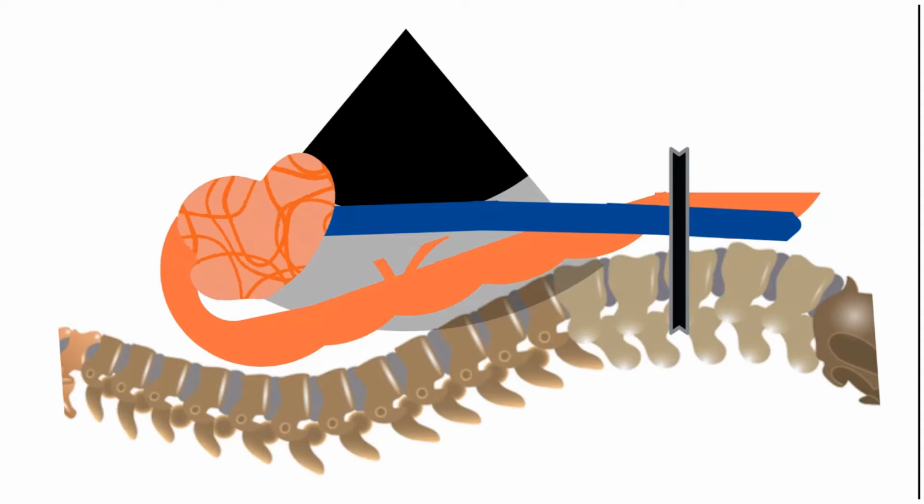Now, I've always said that if you want to be good at POCUS, you have to be good at anatomy. So observe the anatomy here. The IVC tends to go straight up into the right atrium, whereas the aorta tends to dip below and then goes behind the heart to enter from above.